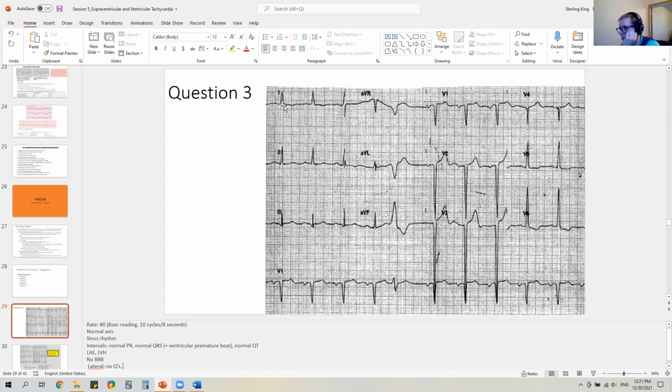ST segment. It's pretty close. It looks like on this side of the baseline and on this side of the baseline, that line is almost crossing the same spot. And over here, it's mostly the same. And this really throws it off. So I'm just going to leave it at that. V5 though. Yeah, it looks like that's depressed. You can just see this baseline to that baseline is definitely lower, and V6 without question. So V5 and 6, I'll actually put them down here. V5, 6. So depressed ST segment.